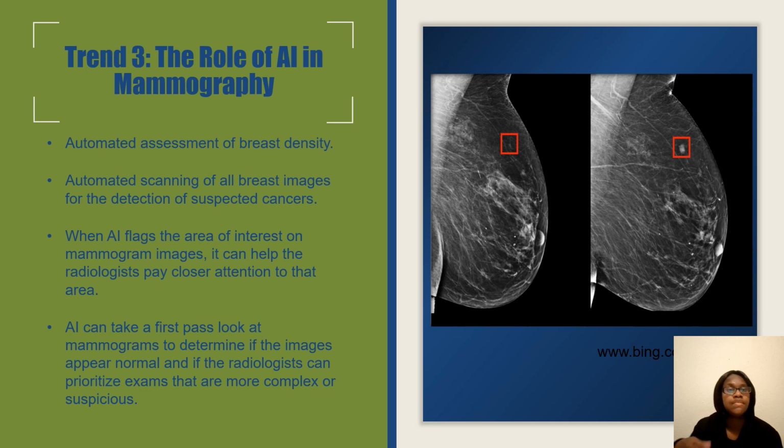So the role of AI in mammography: it can help scan the breast images for detection of suspected cancers. It can help flag and categorize which images are more important.